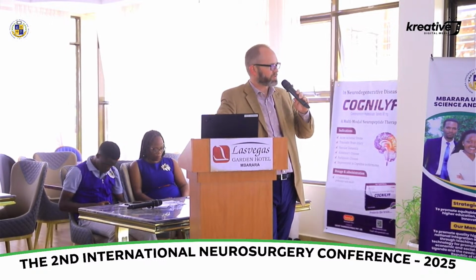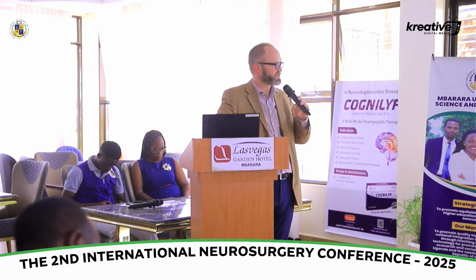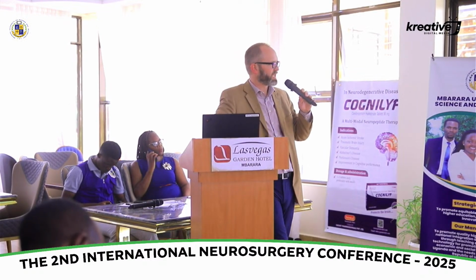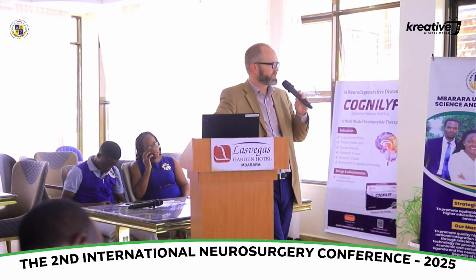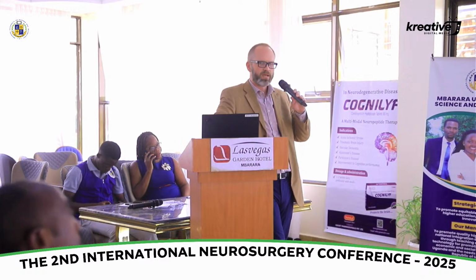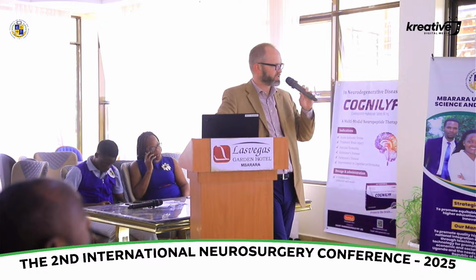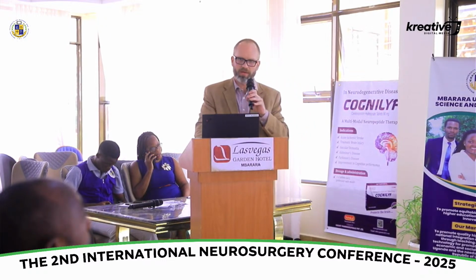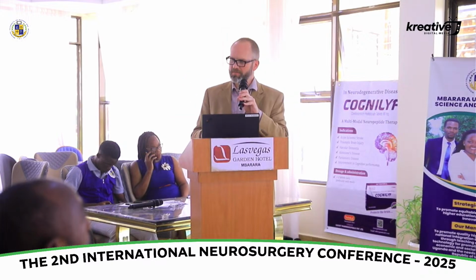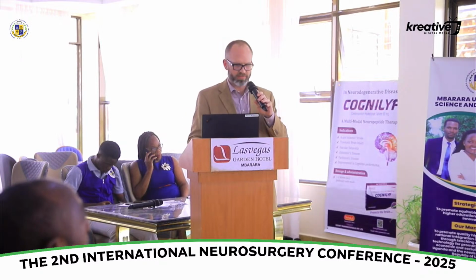understand basic ultrasound anatomy of the brain, using standardized approaches, orthogonal views. Ensure an improved understanding of what's being visualized, understand how pathology affects the echogenicity of various structures, learn how common artifacts lead to misinterpretation of imaging characteristics throughout the resection, and the best way to learn that is to image frequently during a procedure. And if you do that every time, then you'll get better at recognizing artifacts.